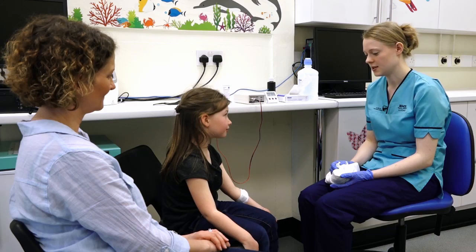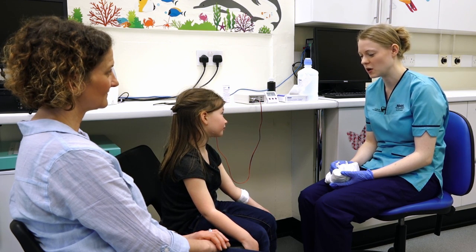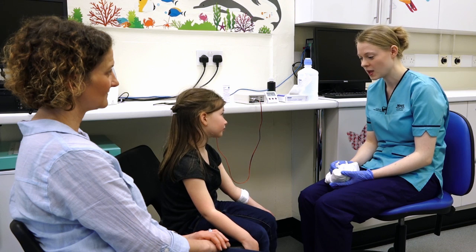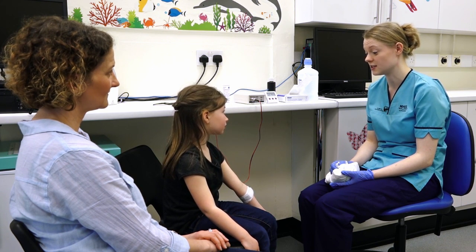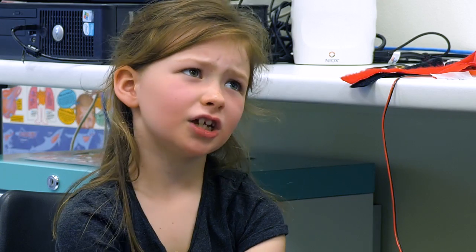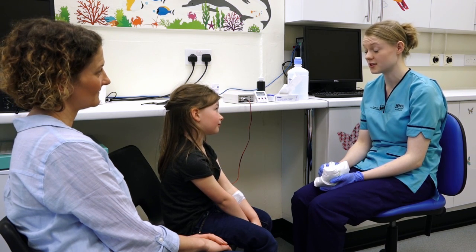How long does it take? It takes about 20 minutes for us to collect your sweat. Sometimes we need to wait a wee bit longer to get a bit more, and sometimes people need to come back another time to have the test done again if we don't get any sweat. Do you do this test on babies or teenagers? Yes, we do it on babies, teenagers, and sometimes grown-ups as well.